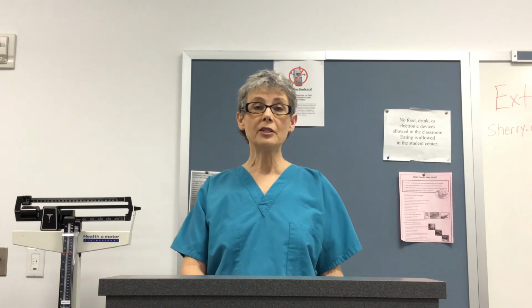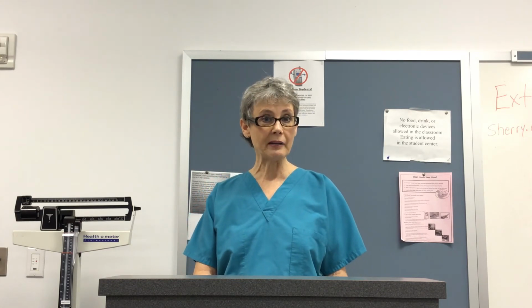So don't be discouraged if you try to aspirate for blood and it does not come back. But if you can, aspirate, because that is one way to know that your catheter is in the vein.